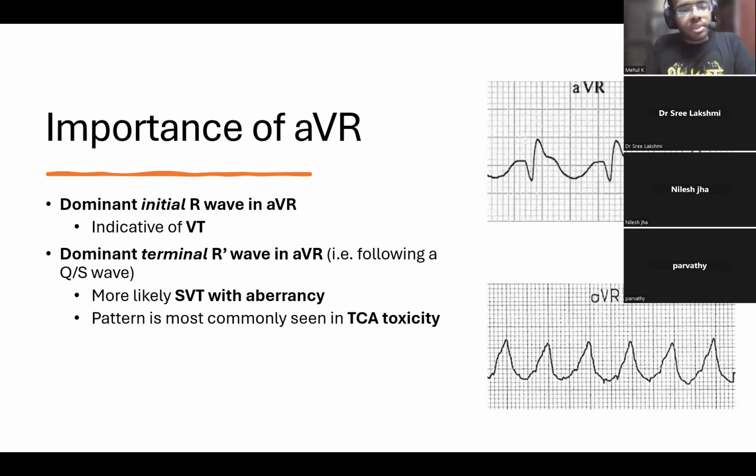On the flip side, if you see a dominant terminal R dash wave in aVR, like the top image here, that kind of favors an SVT, very, very classical of your TCA toxicity.